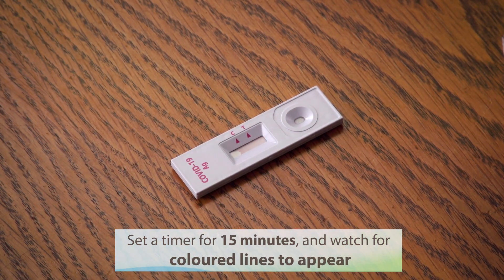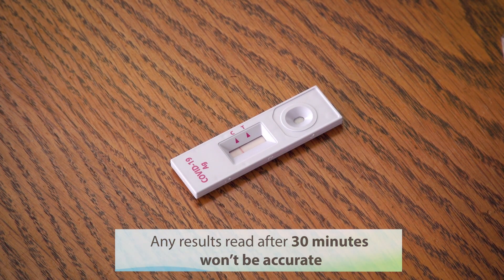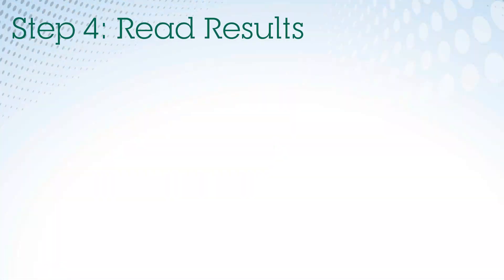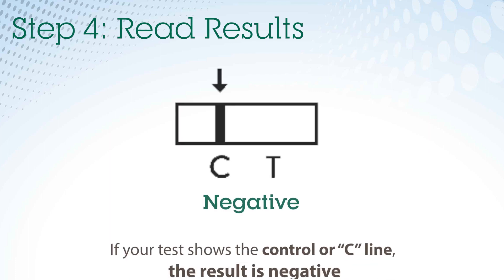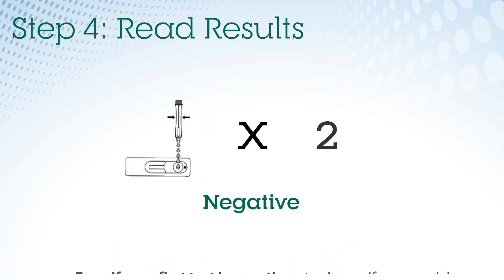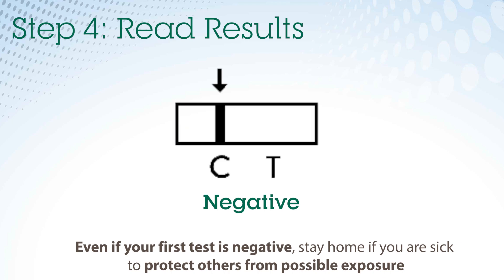After 15 minutes, colored lines will appear and you will be able to read the results. Do not read results past 30 minutes because they will no longer be accurate. Step 4: Read your results. If it only shows the control or C line, that means it's negative. Continue to monitor for symptoms and test again if needed. Even if your first test is negative, if you are sick or have any COVID-19 symptoms, stay home to protect others from possible exposure.